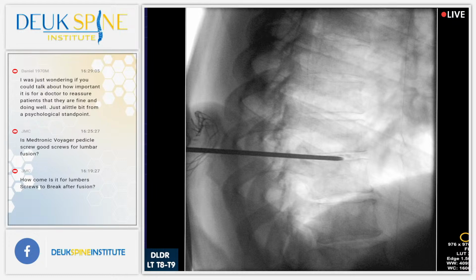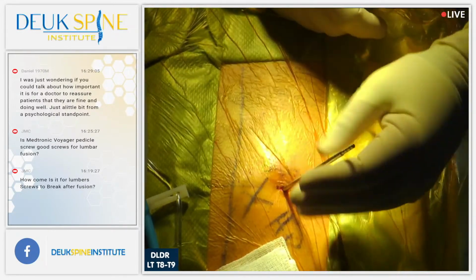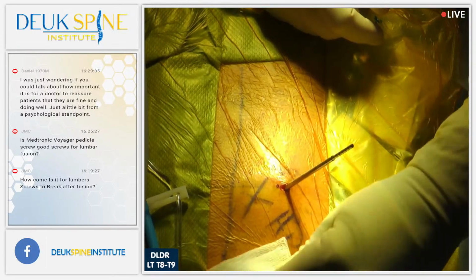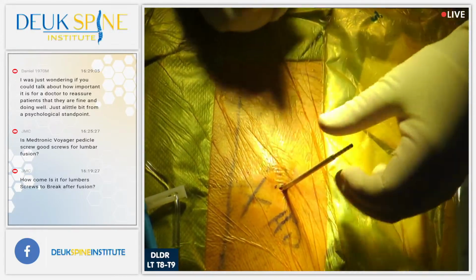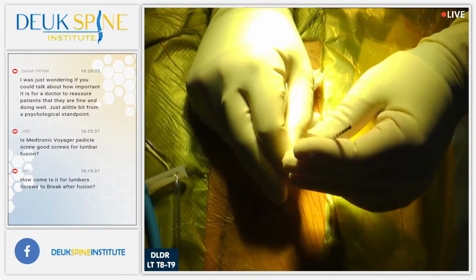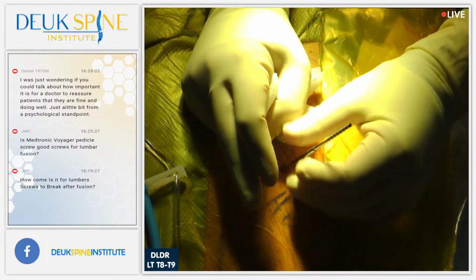Okay. So the whole surgery, folks, is going to be done through this little tube. That's it. And by the way, this is outpatient. This patient's going to go home in 30 minutes after the surgery's over. Oh, what do you know? I made the incision too big. I made 1 millimeter too big. So I made a 5mm incision instead of a 4mm. Of course, I'm joking with you. 1 extra millimeter, not a big deal, right?